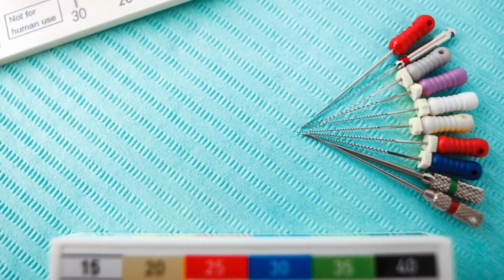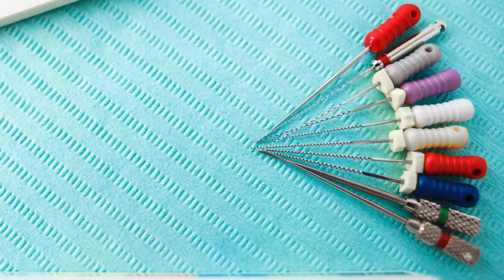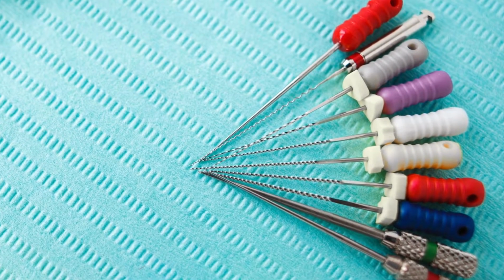To help ensure that you're adequately cleaning the inside of the tooth, how large your final apical diameter is of your final file is very important to determine for every tooth that you treat. So a review of literature will show that there's some controversy among providers in how they actually determine that final diameter for the canal preparation. Now, some dentists prefer to taper the canal and leave the apical area as small as possible, while other dentists actually prefer to enlarge that apical area as much as possible without actually weakening the tooth.